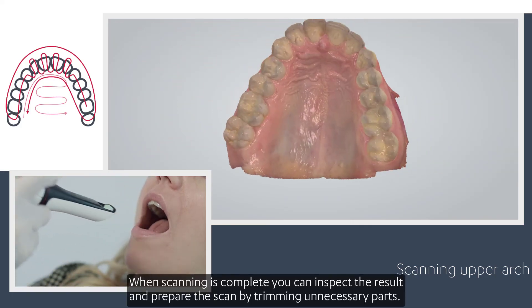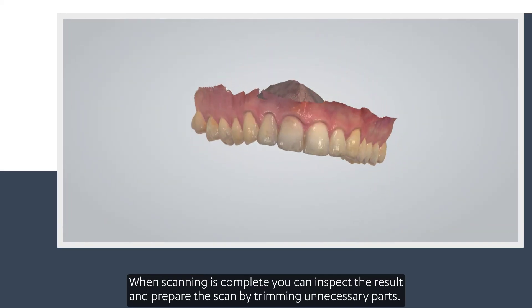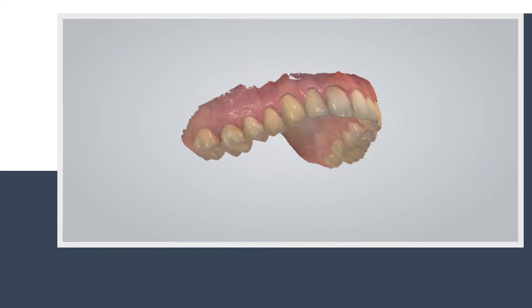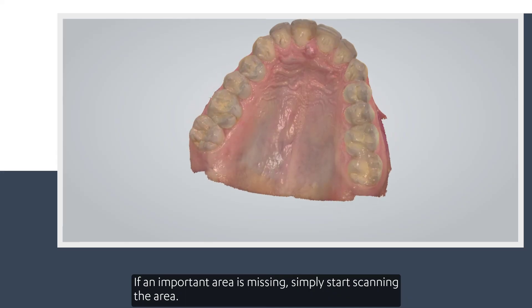When scanning is complete, you can inspect the result and prepare the scan by trimming unnecessary parts. If an important area is missing, simply start scanning the area.